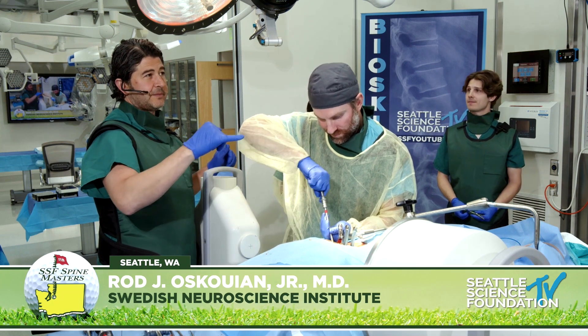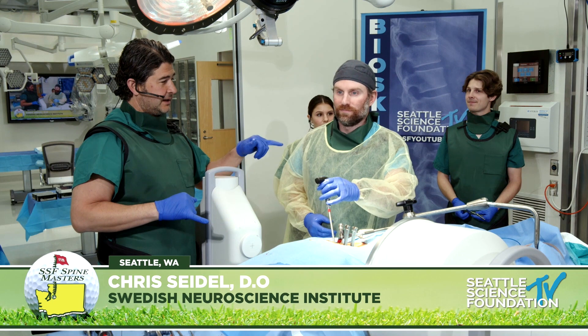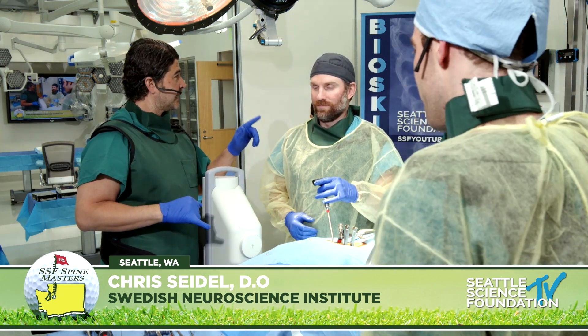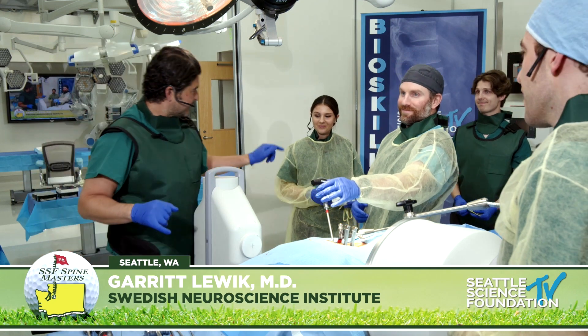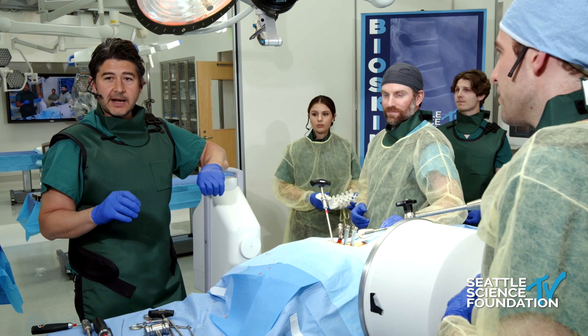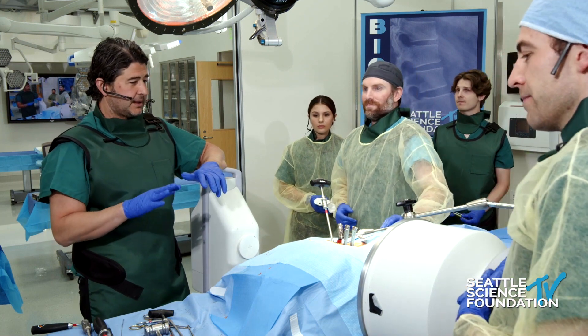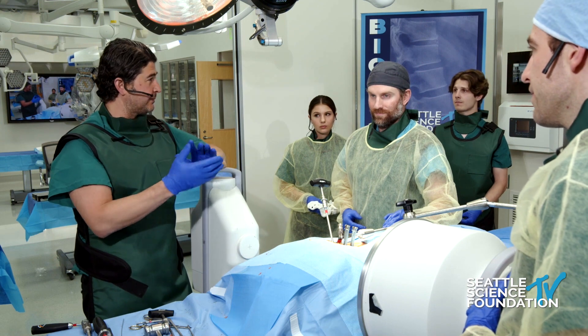He's already trying to bail from the case. And then Chris Seidel is doing the T-LIF. And then Mitch Young and Ava is here. So we're doing an MIS T-LIF, and I wanted to go over some nuances with the approach.